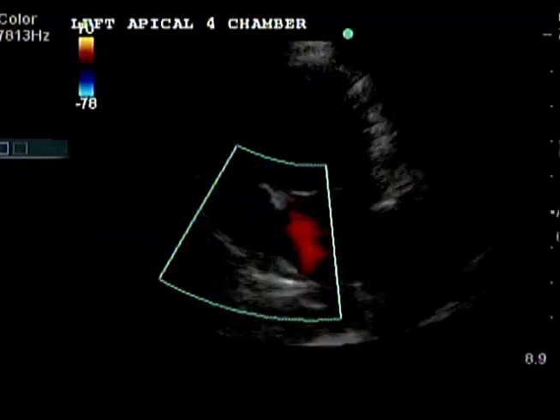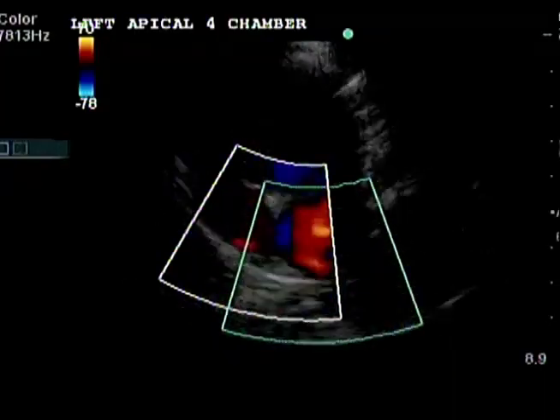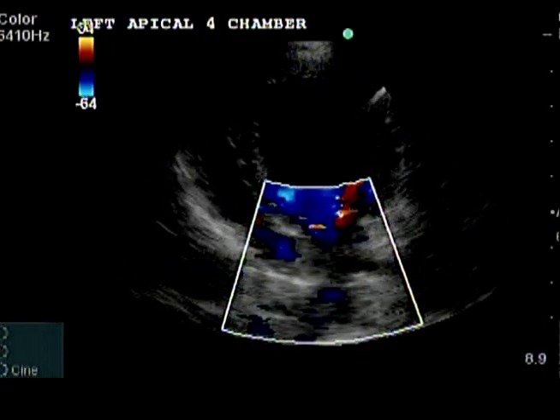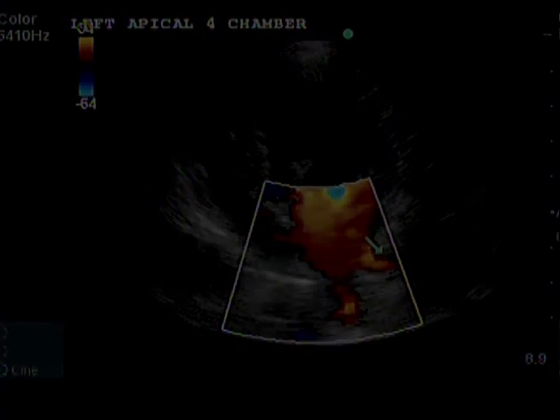The pulmonary veins can also be seen from the left apical four-chamber view in this dog with mild mitral regurgitation. Color flow helps identify the veins, and turbulence of the insufficiency does not enter the veins in mild cases. Two veins enter near the left atrial septal wall, and two more near the left atrial free wall.